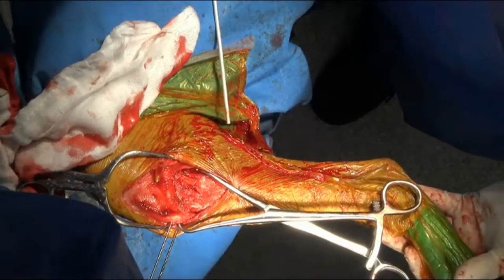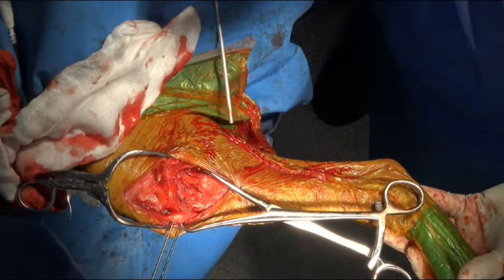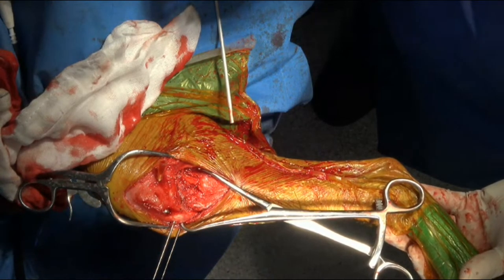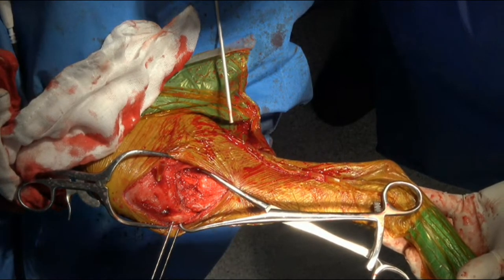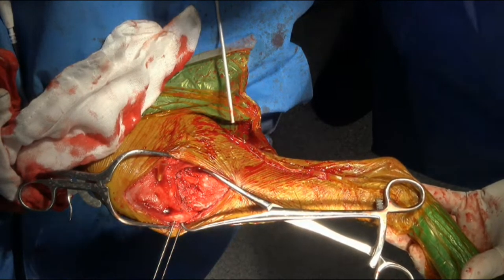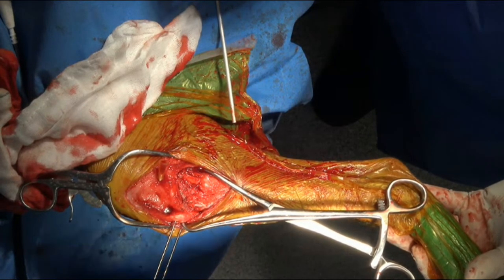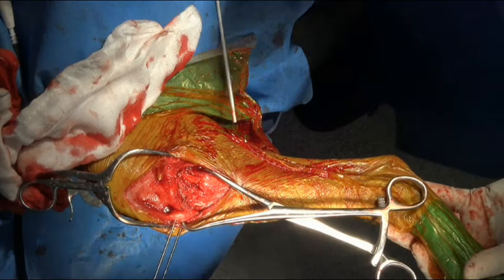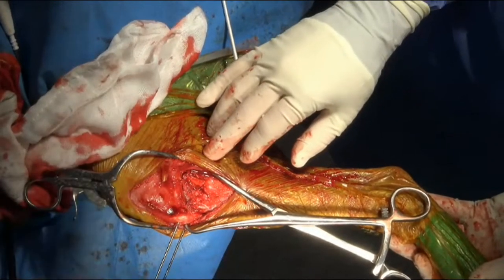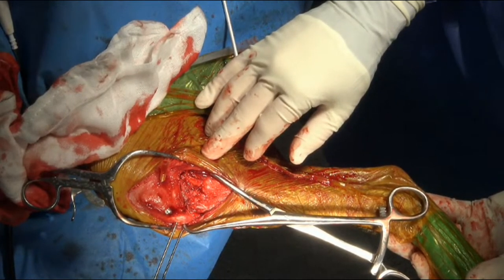So now that everything's locked in place, I can just talk to you guys a bit more if you have any more questions. The next thing I'm going to do is get a 3.2 cannulated drill, and we're going to run that over the top of the first pin that we put in. And you'll notice that is actually going to go through the patella tendon a little bit. And so I'm not really too stressed about that.